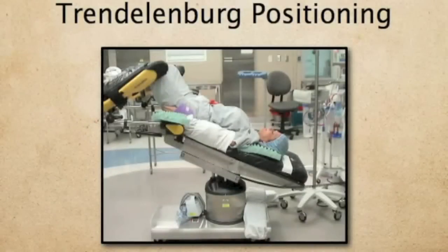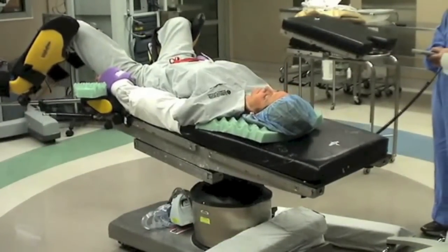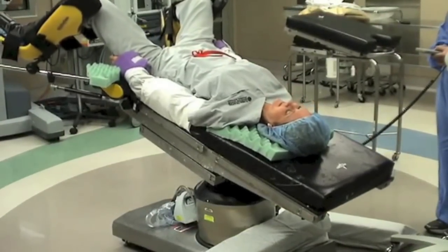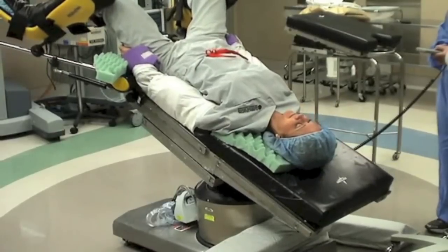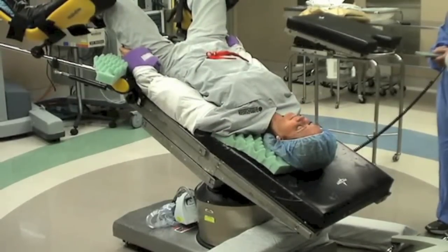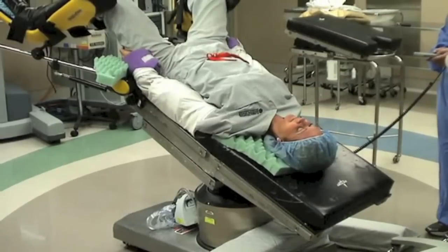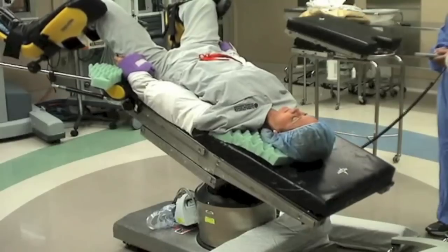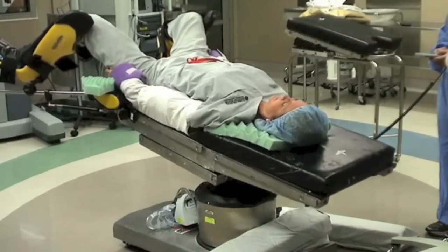Trendelenburg positioning. Once peritoneal access has been obtained, the patient can be placed in the maximum Trendelenburg position as allowed. Again, the patient is not taped to the bed and no shoulder braces are used. The technique of using a bedsheet and the egg crate foam is sufficient to prevent significant slippage of the patient.